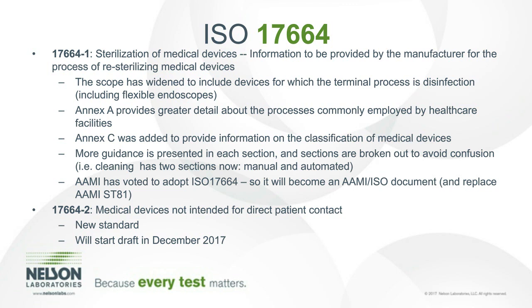What I'm excited about is the ISO 17664, medical devices not intended for direct patient contact. This is something that we're seeing very commonly being tested, and there's no guidance around it. So a lot of the times we're putting them into scrutiny with the disinfection acceptance criteria, and they probably don't fit in those Spalding classifications either.